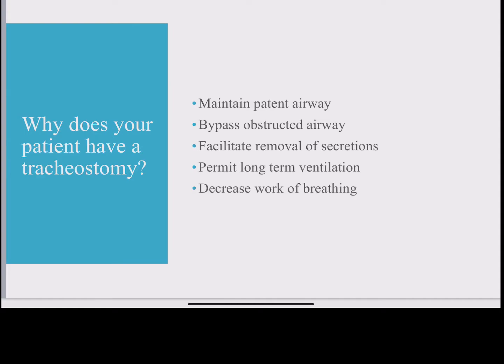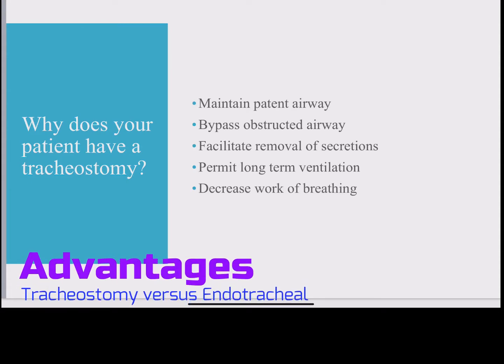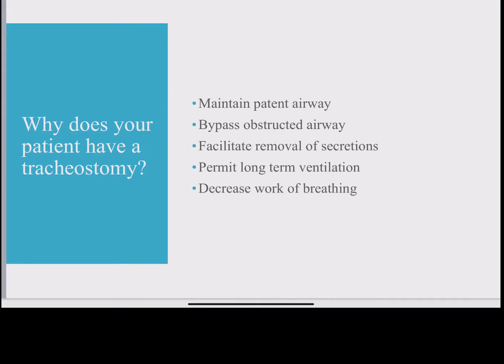Another airway that patients can use is an ET tube, but what are the advantages of tracheostomy versus the ET tube? Well, let's draw our patient who is basically laying down here.